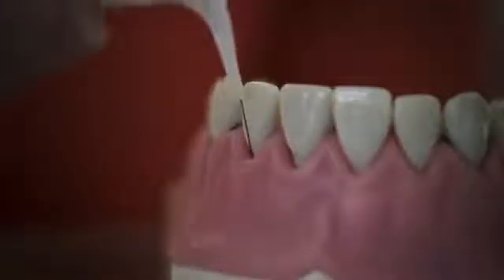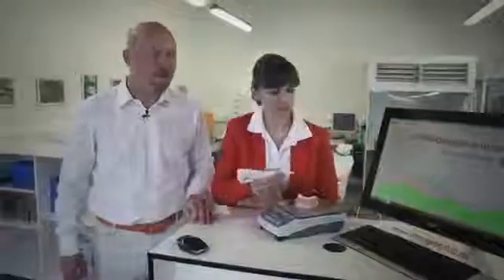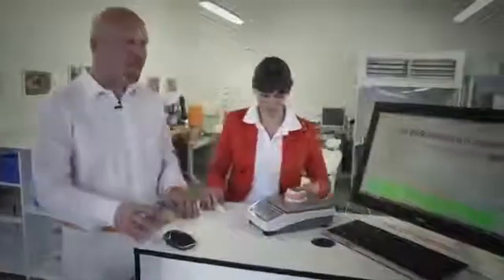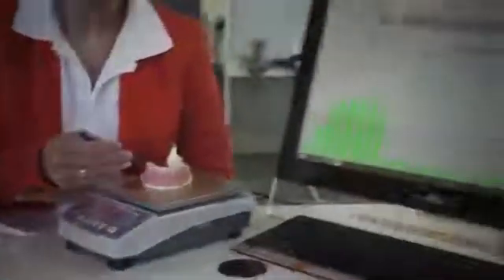The hygienic disposable measuring tip is calibrated so that it always develops precisely 20 grams of pressure. It is so difficult to always measure with exactly 20 grams using a manual probe. Depending on the dentist or the hygienist, the pressure varies and is often much more than wanted.